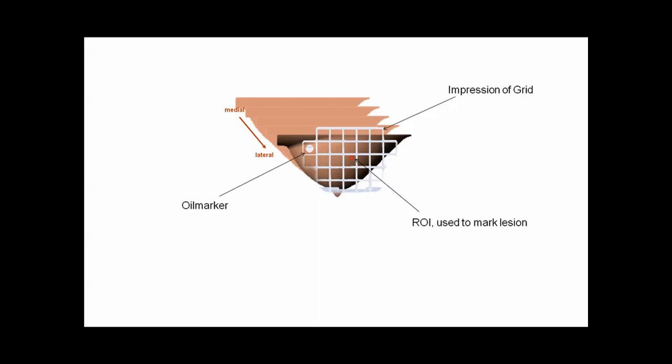Now you can find out the X-Y coordinates by counting the openings of the grid in order to find out where the needle block needs to be inserted. Use the oil marker as reference. You are also able to calculate the coordinates by taking the slice thickness, adding the gap, and multiplying this by the number of slices. This will give you the penetration depth of the needle. In order to get a more detailed distance of the penetration depth, you can also use axial images and insert an auxiliary line to measure the distance to the lesion.